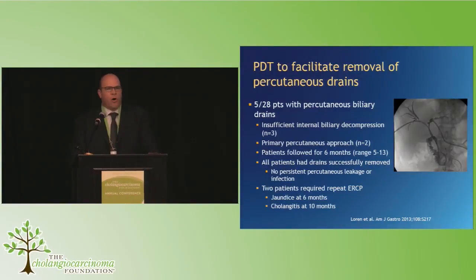In our experience, we've also been able to use photodynamic therapy to remove percutaneous drains. So if you remember my patient who has drains, he had 2 drains coming out of his side, but he's a windsurfer and he is a sailor, and having drains out his side was not compatible with how he wanted to live his life when he knew that his time was limited. And we were able to remove his drains. And we're now up to 8 patients who have come to us with percutaneous drains. All 8 have been able to have their drains removed with the use of photodynamic therapy and internal stenting.